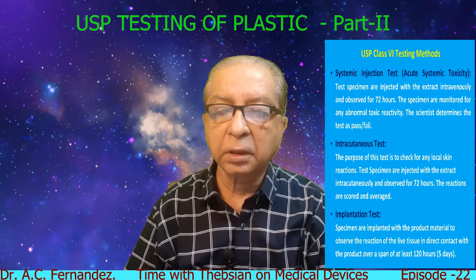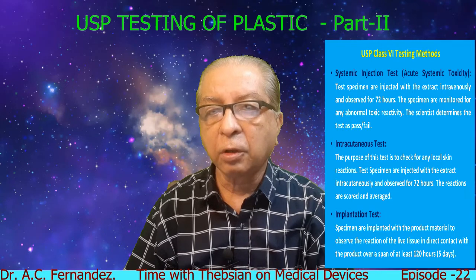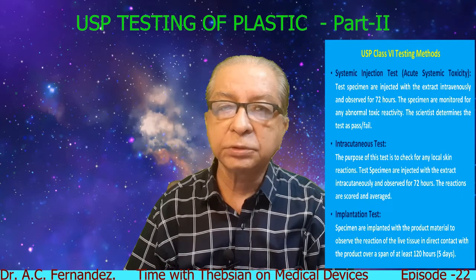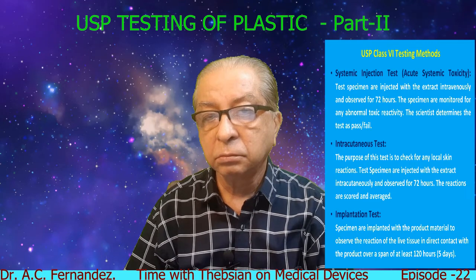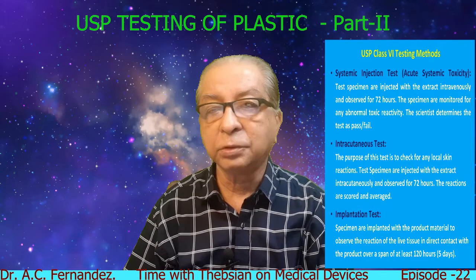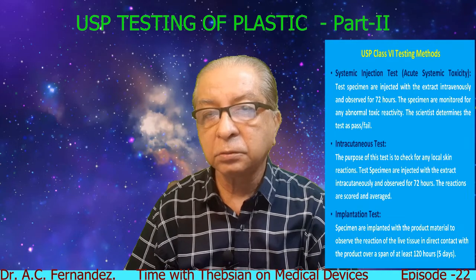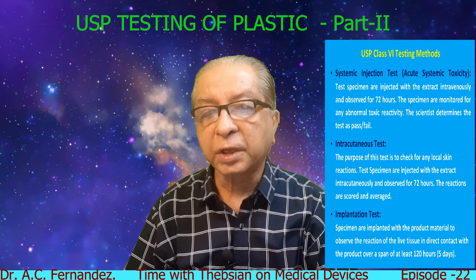So as I mentioned, these tests are used for plastics coming into contact with the human body also, because plastic blood bags, plastic saline bags, IV sets, these are all made up of plastics. So actually they have to undergo the USP testing. So the saline for injection, especially saline for diluting various drugs for injections, come in plastic bottles only.